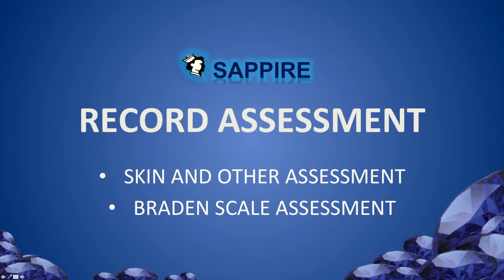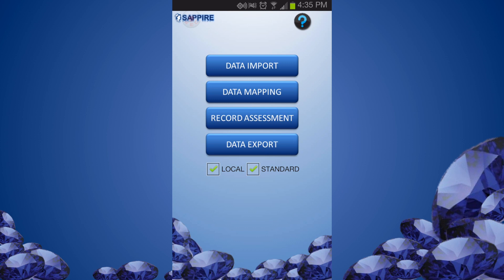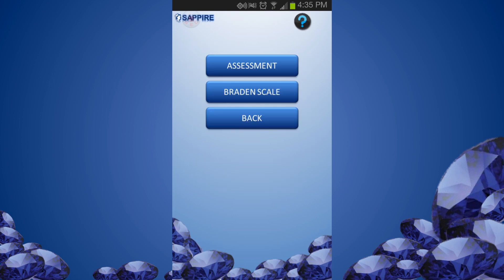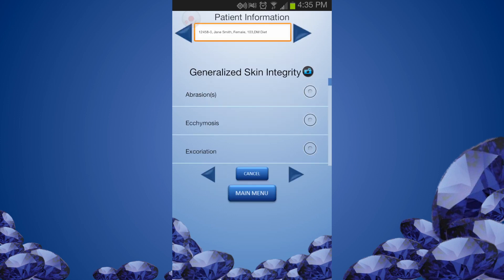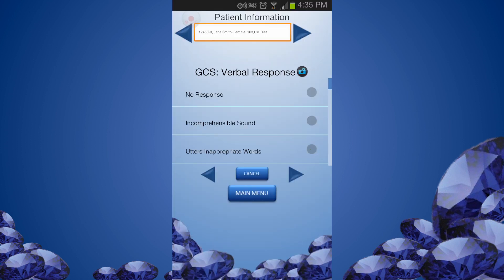Now we are ready to document assessment data. From the main menu, click Record Assessment and select the patient to work on. Select Assessment to record skin assessment. Select values and move to the next item using the scroll arrow. You can also take a picture of the skin image.